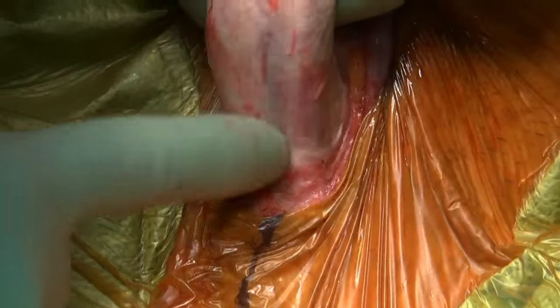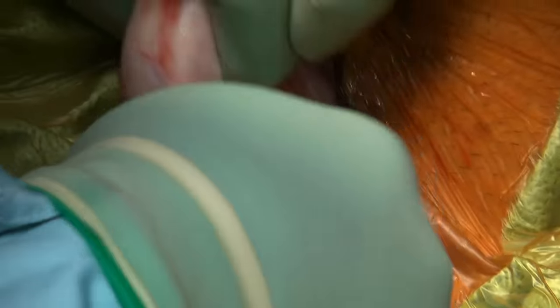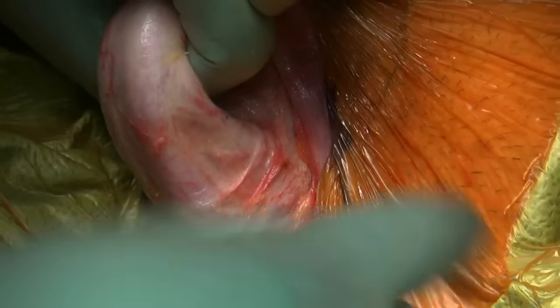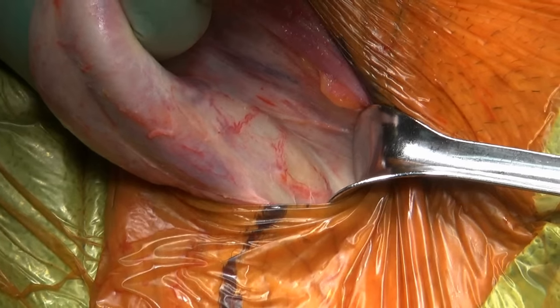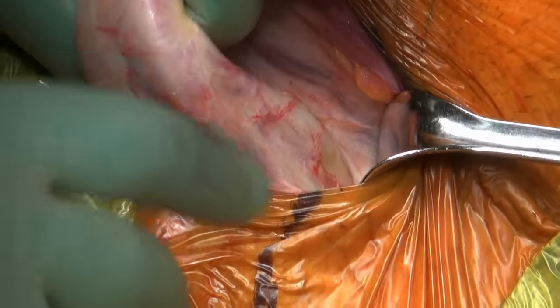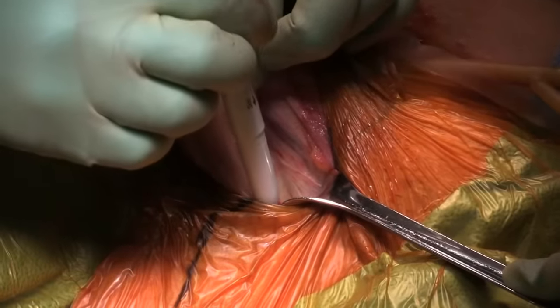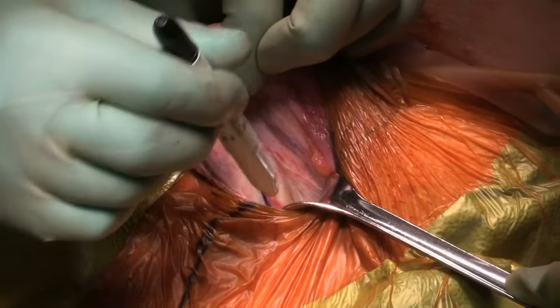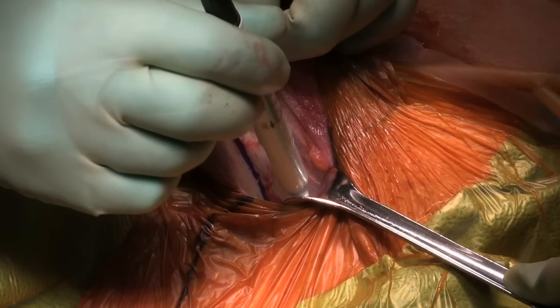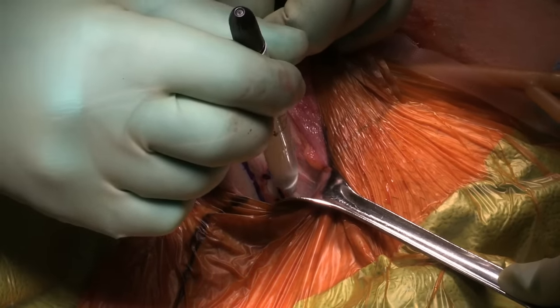Here we have a beautiful anatomic plane where we can see the cleft between the corpus cavernosa and the corpus spongiosum. Now I can develop this avascular plane which will lead us down all the way to the insertion of the corpora onto the inferior pubic rami. We can also see the crossing of the ischiocavernosus muscle. I now want to mark the site of our corporotomies. I mark the groove between the corpus spongiosum and the corpus cavernosa. There are crossing veins and I prefer to leave them in situ. The line marks the location of my incision and these dots mark where I am going to place my stay stitches.